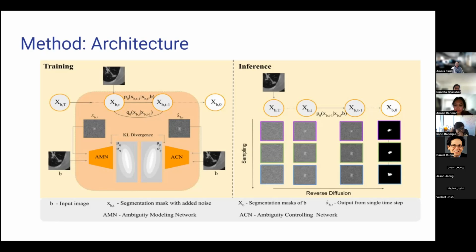So it can basically generate an output with no mask in it if it sees a patch without a tumor. I was not sure if you were feeding all the patches, because in the image you are only showing the patches with the tumor. This is just for CT, but for ultrasound we send the whole slide, and for MRI we also pass just the patches, but it depends.